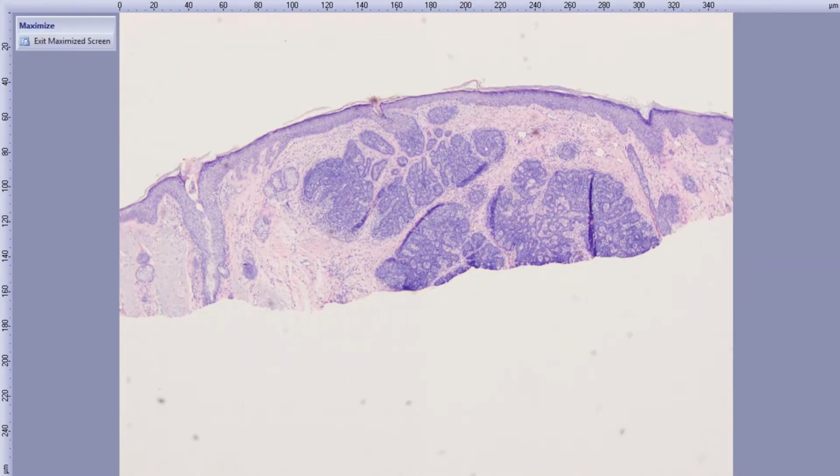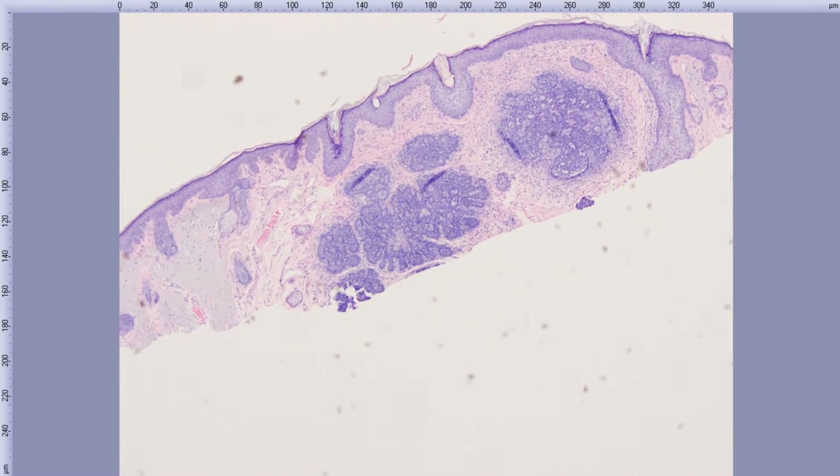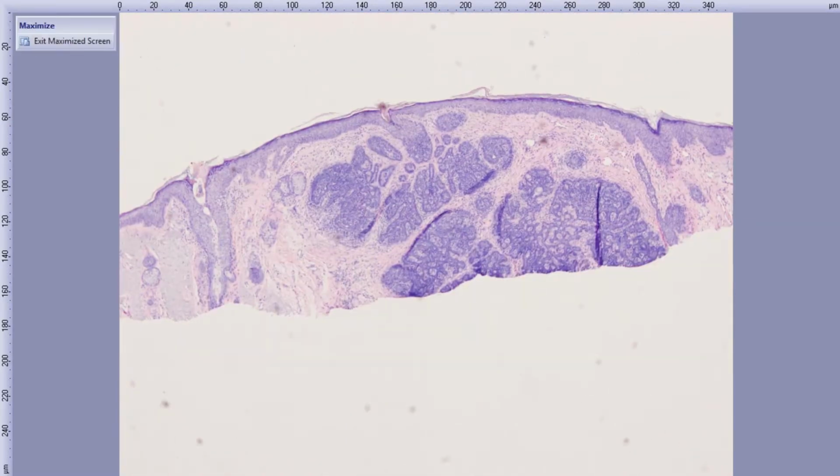And how about this one? Trichoepithelioma. That's right. Yep. And not a trichoblastoma, although there are different subtypes of trichoblastoma. This is small, and it's got really just this reticulated basaloid lobule pattern within a fibrotic stroma. And I guess if we had the perfect triad, we'd like some horn cysts. So that's the triad.